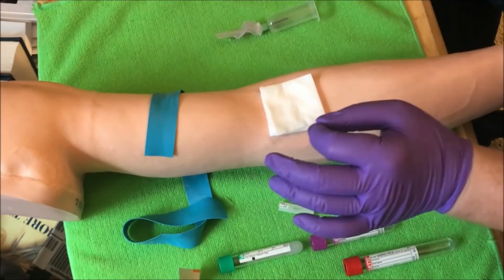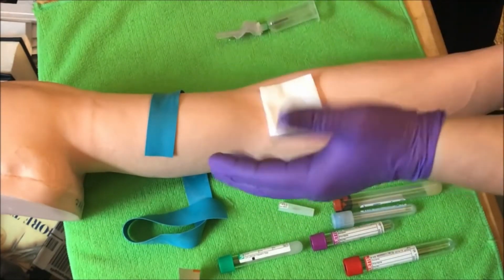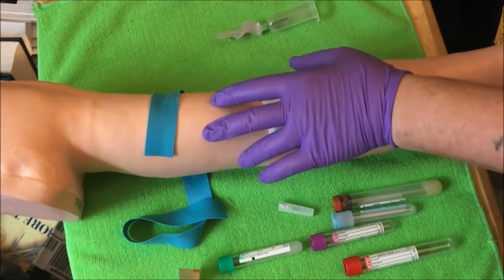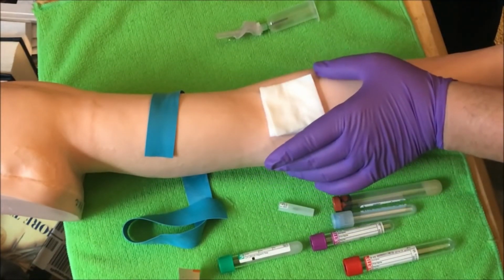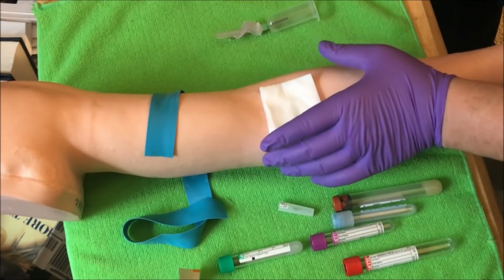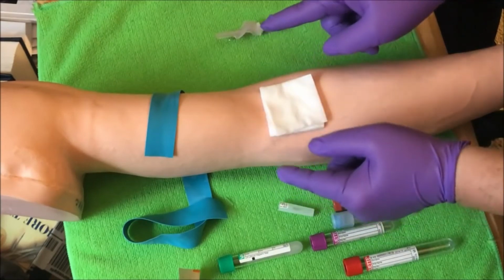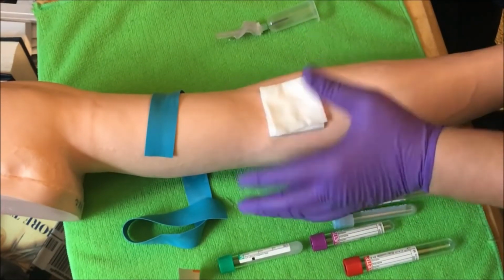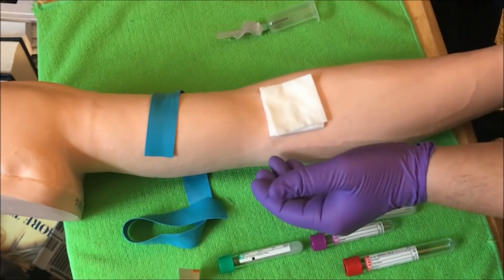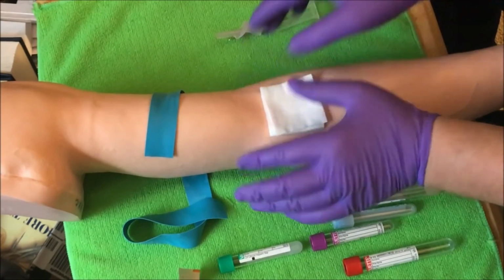I do not use tape, and I do not use Band-Aids. Again, CLSI does not recommend tape or Band-Aids anymore because tape and Band-Aids can rip the skin, it can cause skin irritation, and again, discomfort for the patient. We use Coban, self-adhesive Coban. I wrap the arm in Coban, not tape and not Band-Aids. That prevents any irritation or tears on people who have sensitive skin. The Coban is self-adhesive, it wraps around. I keep it on there.